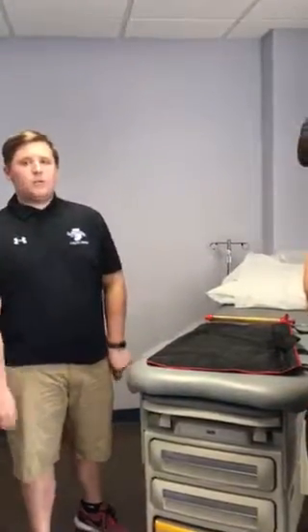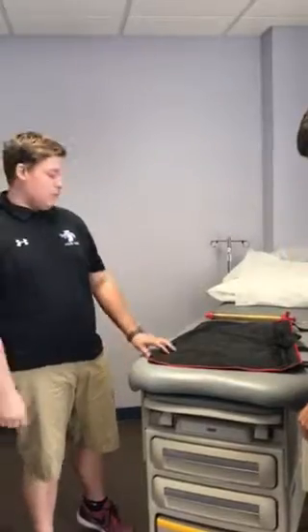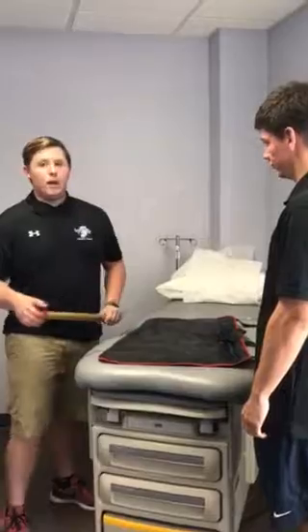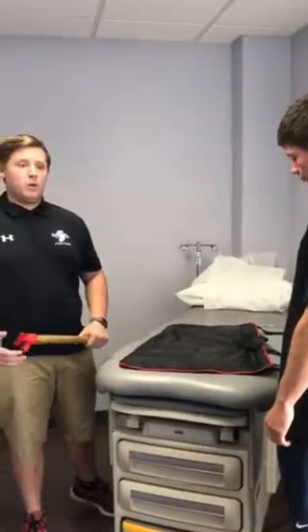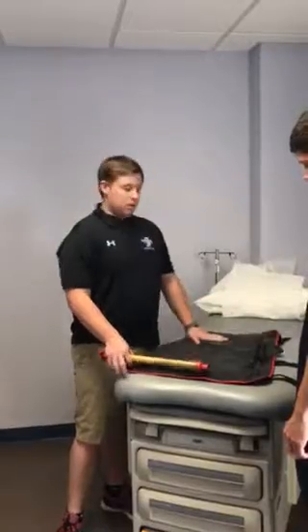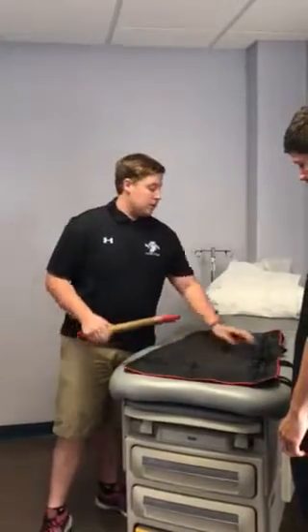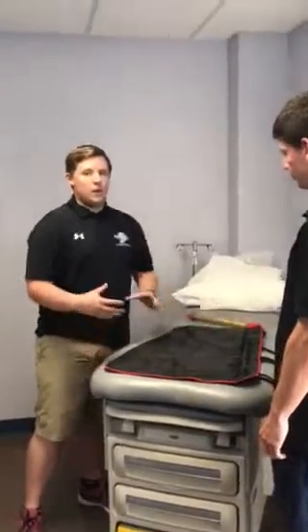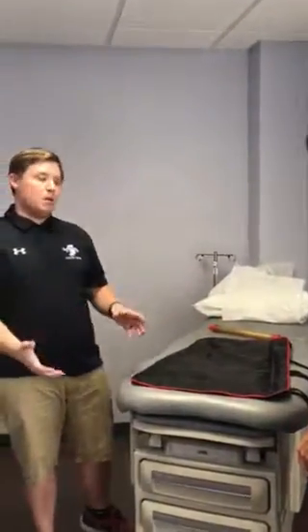I am a master's student in the Indiana State University Athletic Training program, and today I'll be going over a vacuum splint. You may hear it called a rapid form vacuum immobilizer as well. Today I'll be going over how to use an upper extremity splint. For any kind of splint, you really want to immobilize the area above and below.